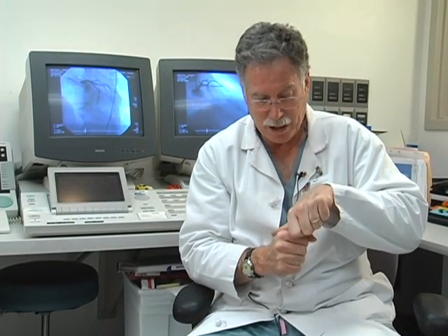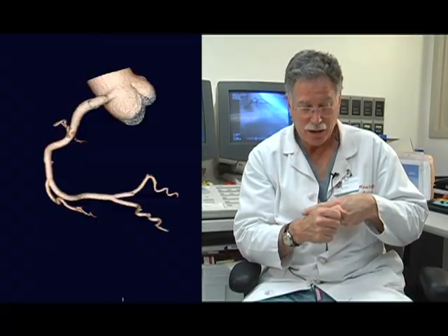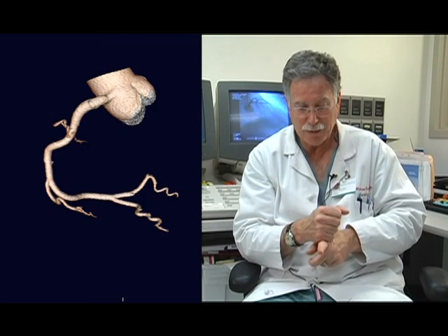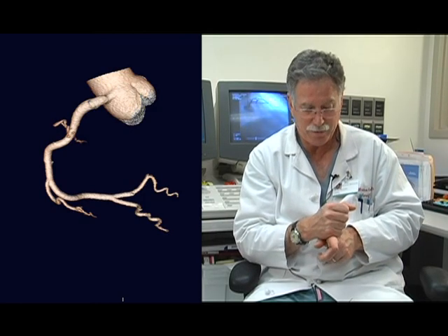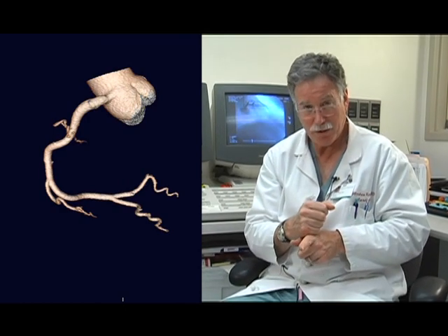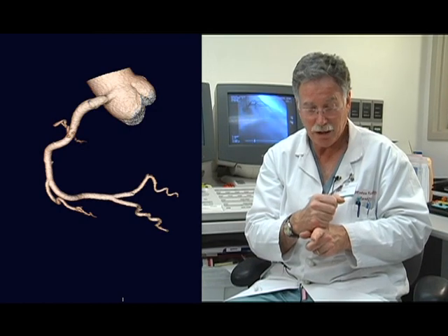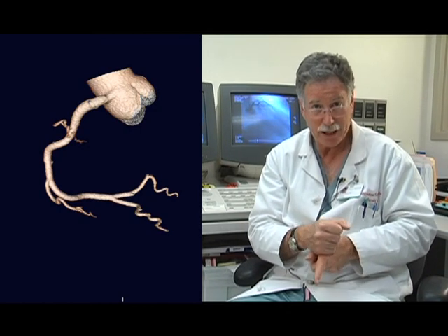And now let's look at the right coronary artery. This is, my thumb is the right. It runs outward in this first projection down the wrist, and the posterior descending comes out toward you. If we rotate now left anterior oblique, that posterior descending is directly in line with the camera. And if we go cranial, it tips the posterior descending artery downward.